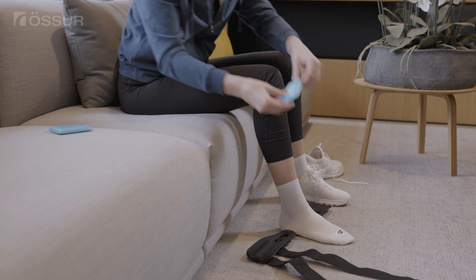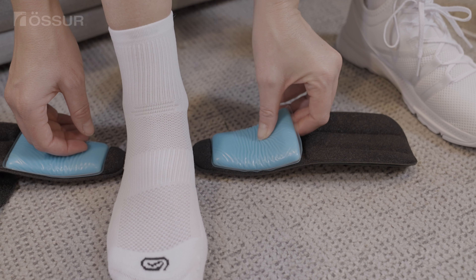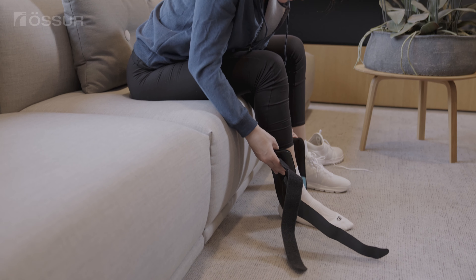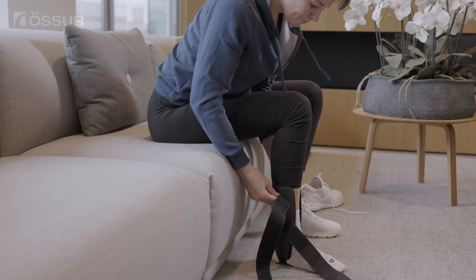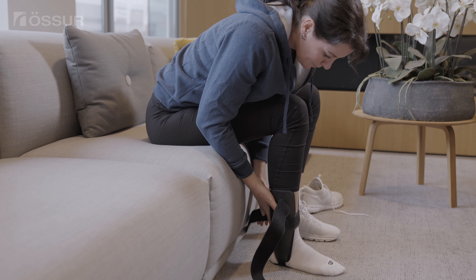Put the gel pads in the device and fasten it. The gel pads can be used for hot or cold therapy. For cold therapy, cool the gel pad in a freezer up to 60 minutes. For hot therapy, heat the gel pad in warm water or in a microwave oven until it is warm but not too hot to hold.